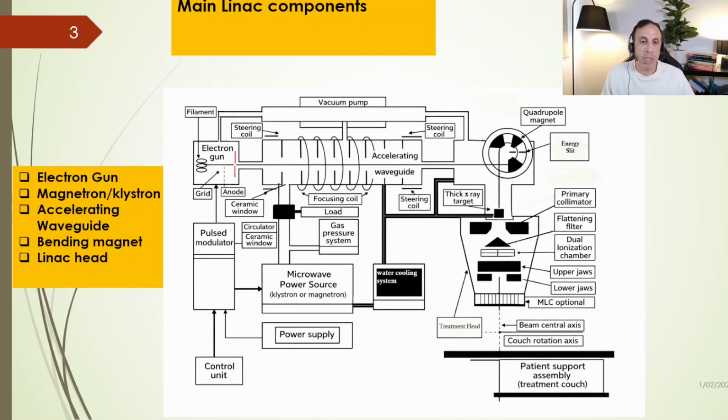The waveguide is made of metallic structures such as copper and is highly evacuated using special pumps called ion pumps. So acceleration of the electrons inside the waveguide happens in an air-free vacuum, which is provided by the ion pumps, and these pumps should work all days as far as we want to have a very stable situation for electron acceleration.